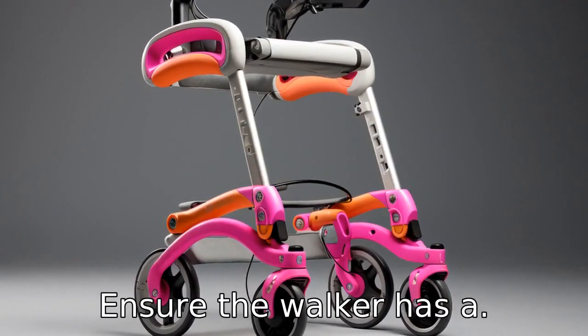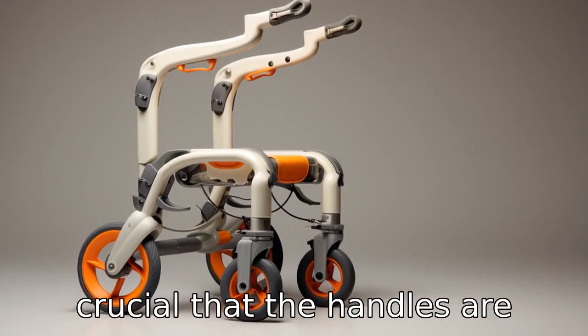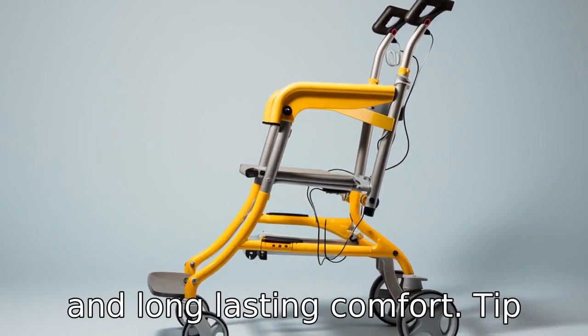Tip 4. Ensure the walker has a comfortable grip. Your hands will be on the walker for significant periods, so it's crucial that the handles are ergonomic and friendly to touch. Foam grips are a popular choice as they allow for both good grip and long-lasting comfort.